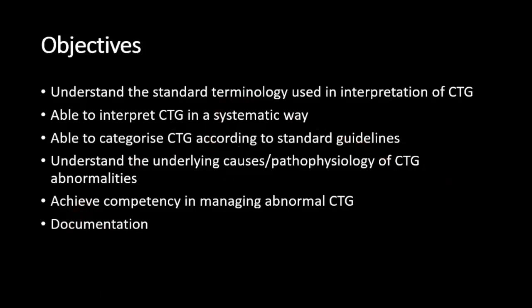By the end of the tutorial, you are expected to be able to achieve a competency in managing and interpreting the normal or abnormal CTG. And last but not least, documentation.